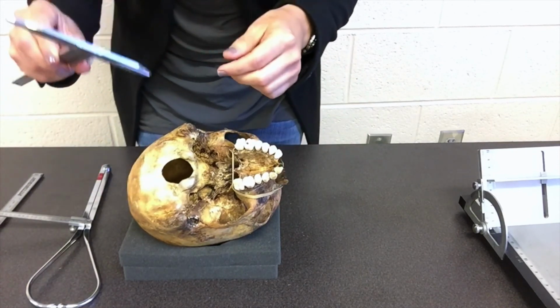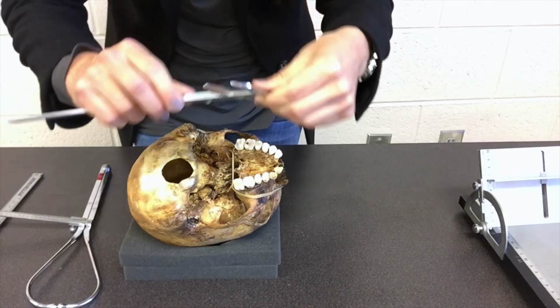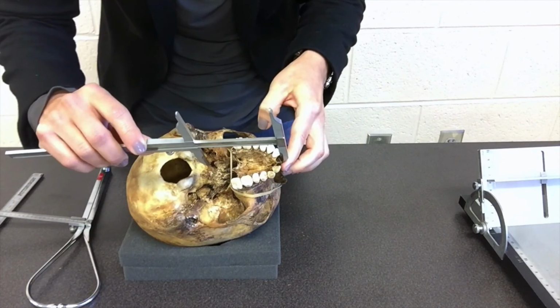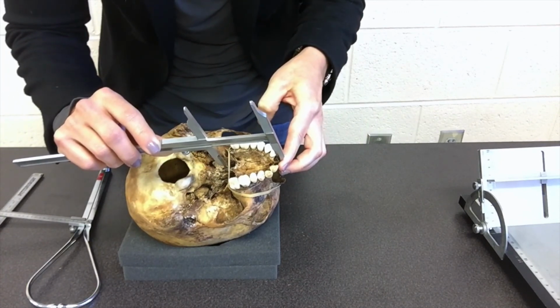I'm going to go ahead and use the sliding calipers. I've got my slide facing me, my rule, and I'm going to apply one end to prosthion, and I'm going to apply the other end in the mid-sagittal plane to the center of the rubber band.